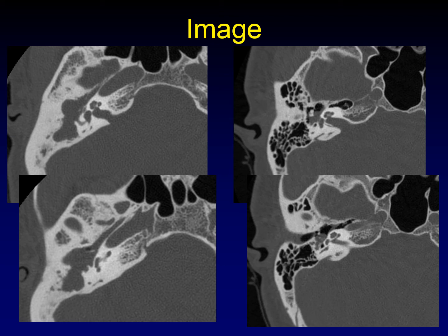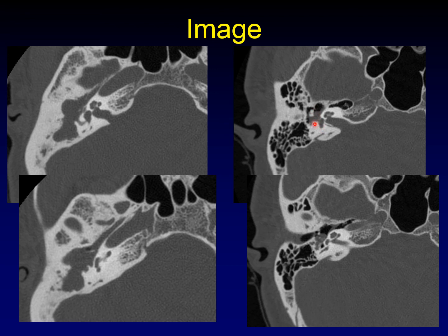So what are our two diagnoses? On this side, all of these erosions in the setting of a middle ear mass suggest cholesteatoma. The bone erosions are the critical finding that indicate cholesteatoma, and the loss of mastoid air cells indicates chronic infection, which is the cause of that cholesteatoma. This is called lateral semicircular canal fistula. On this side, there is no evidence of chronic inflammation — just a mass intimately associated with the facial canal. That's because this mass is emerging from the facial canal. This is a schwannoma of the facial nerve, and it doesn't erode anything.